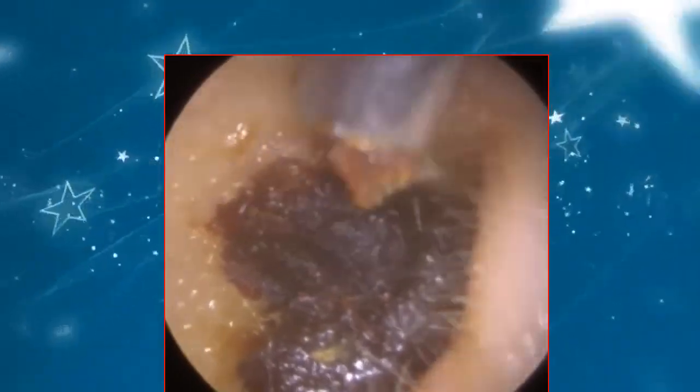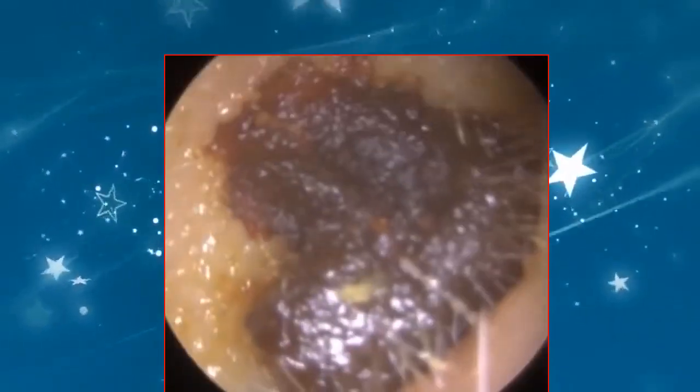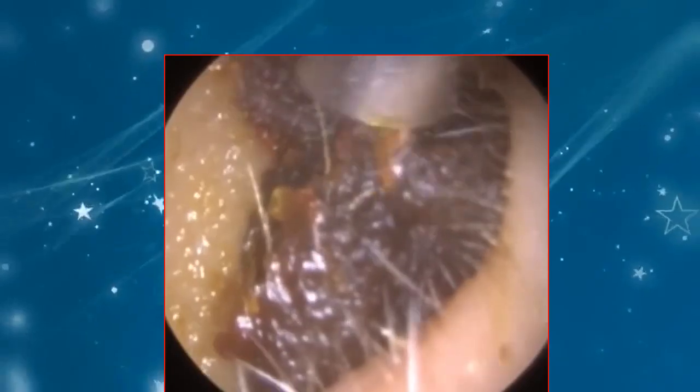So this is the first bend here. So on the left-hand side, you can see the hairs. That's the first bend of the ear canal. And the suction process got blocked there. I'm just trying to give it a little wriggle. So this is the first bend.